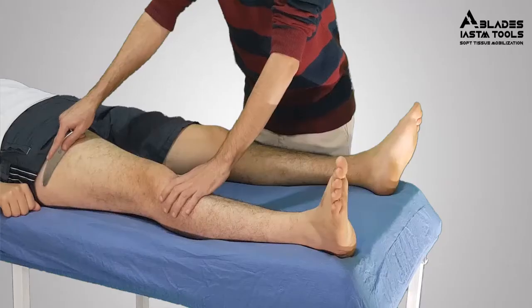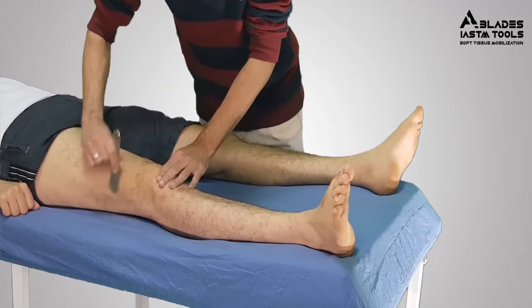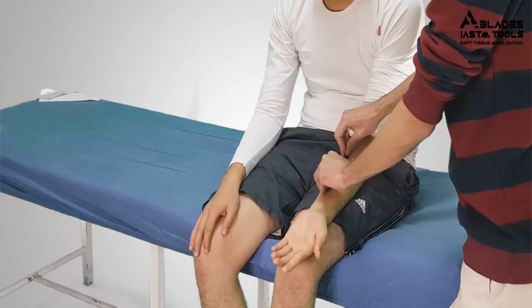We will talk about the basic practical concepts that we should take into consideration that differ from condition to condition and from patient to patient before starting your treatment with the tool. Explain in detail how to use A1 blade specifically, why is it designed like this, and what does every edge in it do. We will talk about the different techniques and strokes and how we apply them.